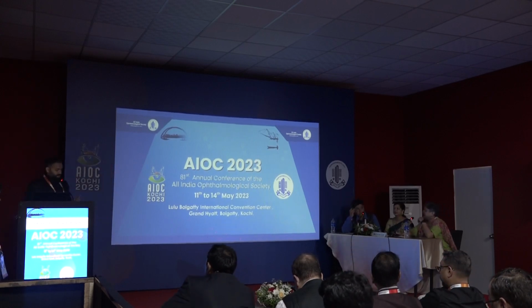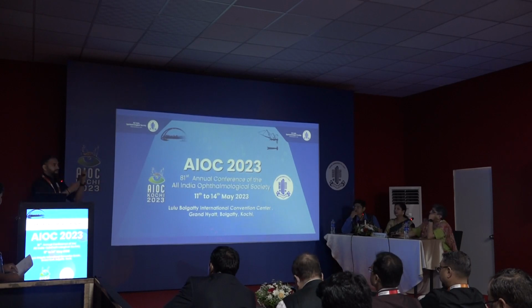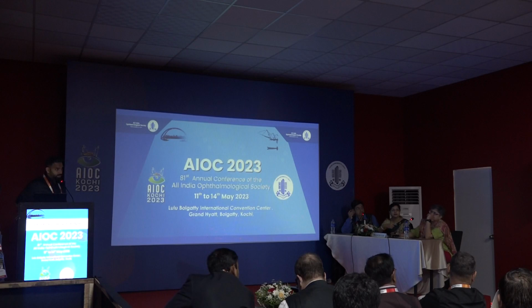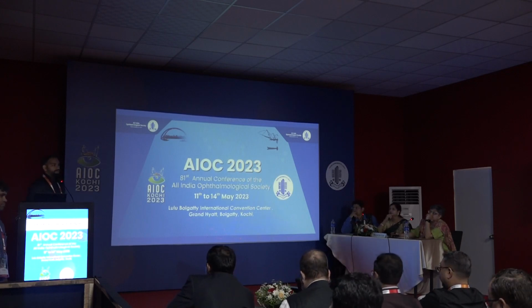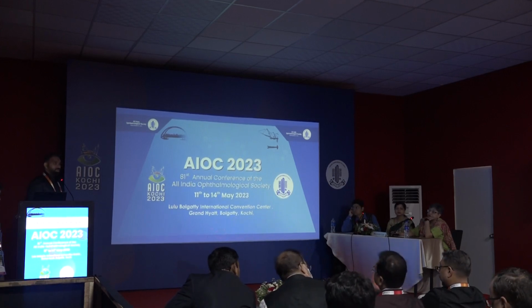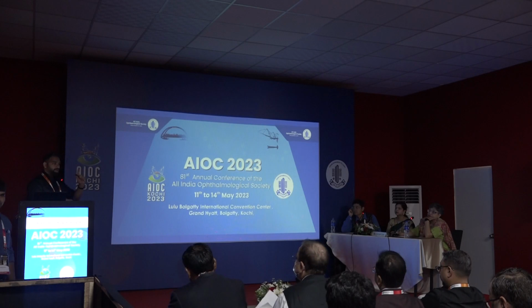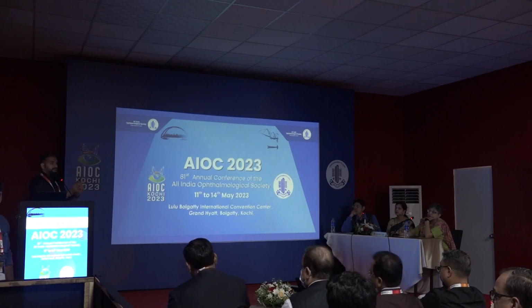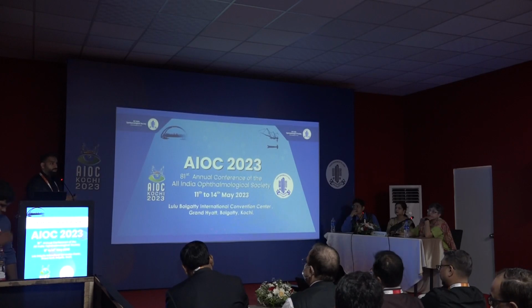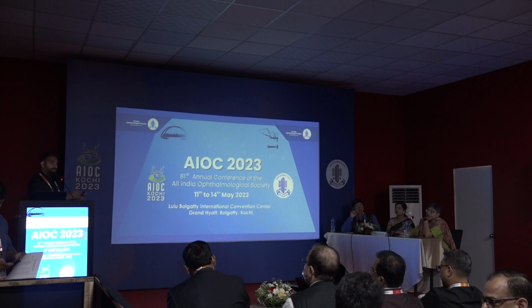Yeah, it is required. Yeah, we can use it, but you will get only one particular diameter. But over here we have different adapters. You can have a circular one, you can have a square one, you can even have a slit one. Slit we can have 1 millimeter, 2 millimeter, 0.5. You can have different millimeters.